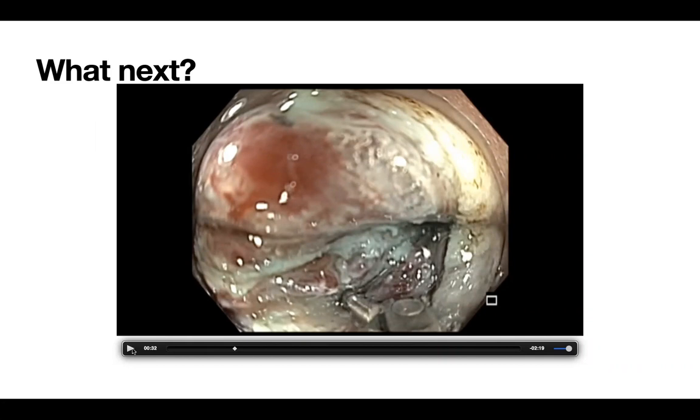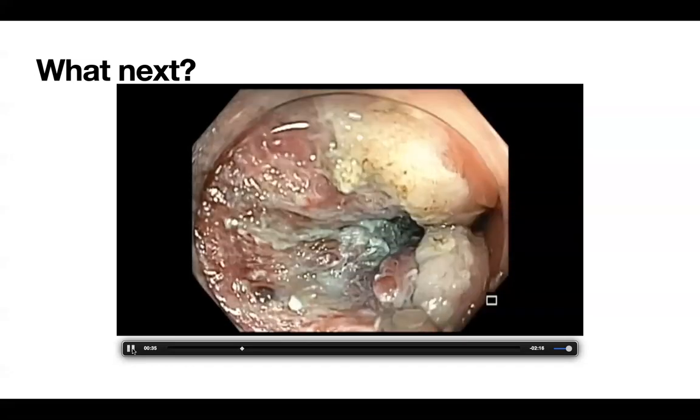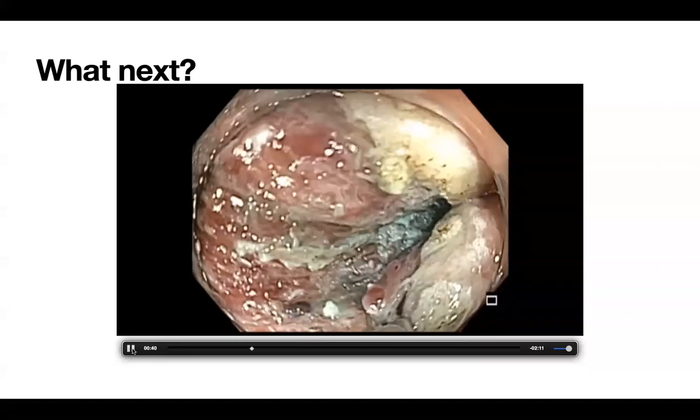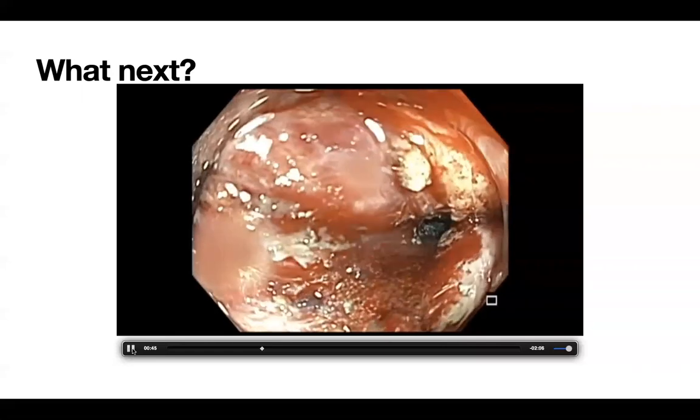Right. So the other thing is you will see something that has happened here. I'm stopping here. This is a very important point for the sake of the fellows or for anybody. It's not just for the fellows. You'll see, I did a nice coagulation for the first two vessels. It went very smoothly. I was happy. And then I tried to get this vessel close to the edge and about to coagulate. And you see what happened.